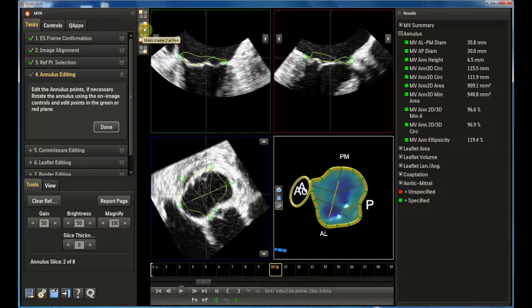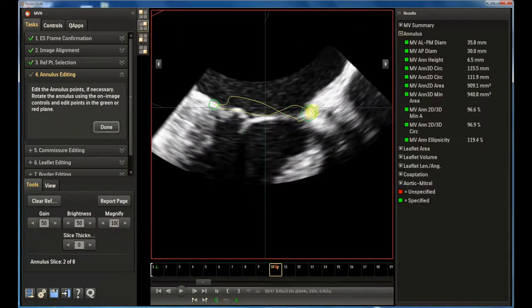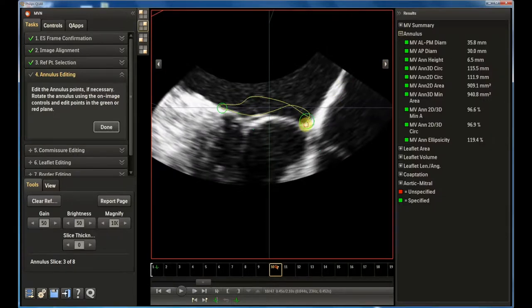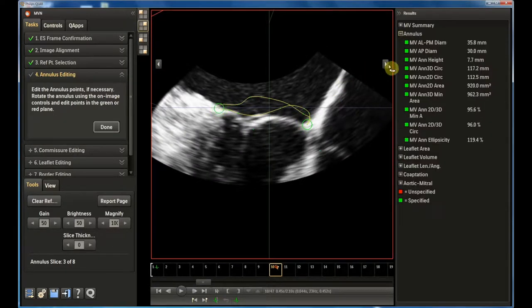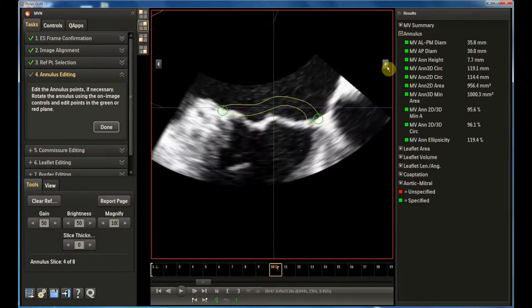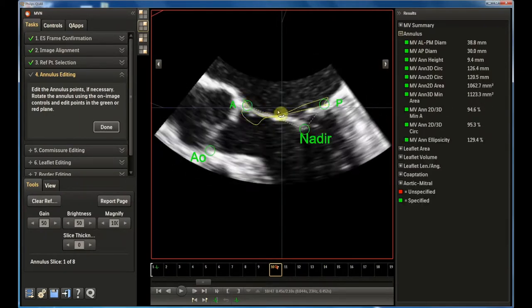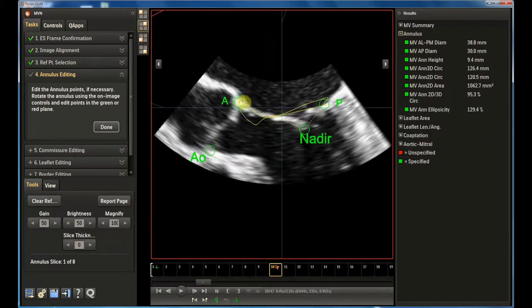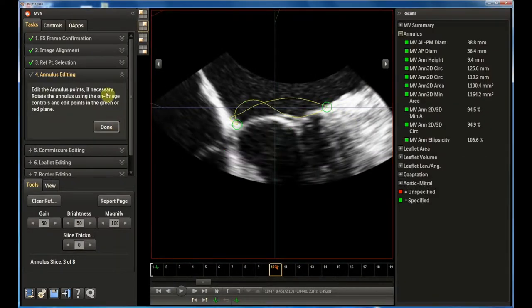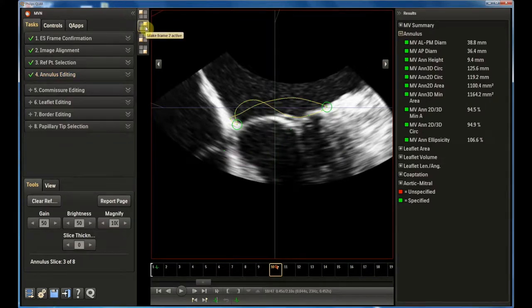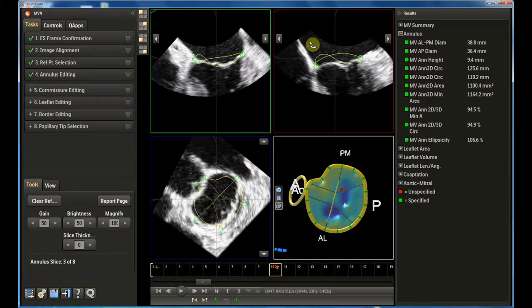By clicking on this button it is possible to magnify one of the panels for a better visualization of the valve. After completing this process, all the variables concerning annulus geometry are available.